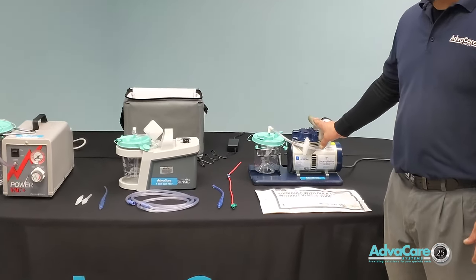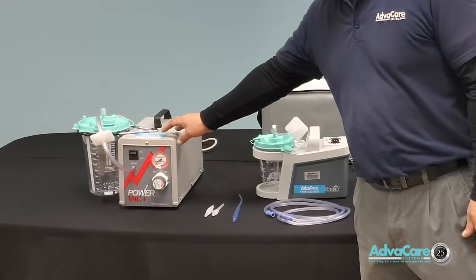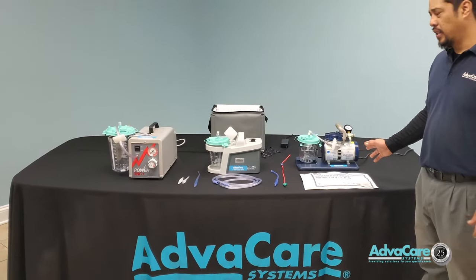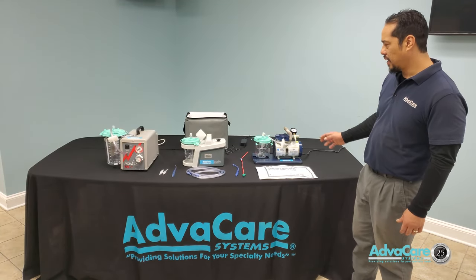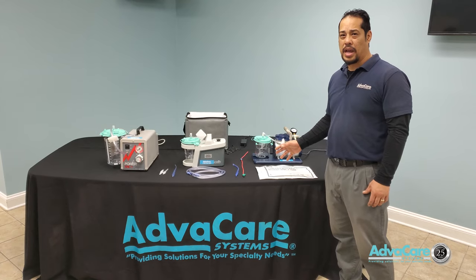We have a stationary suction machine, a portable suction machine, and an intermittent suction machine for gastric suctioning. We'll go through the setup and operation of all three, proper pressure settings, and connections of the canister, the filters, and all suction accessories that you would use to apply suction to a patient.